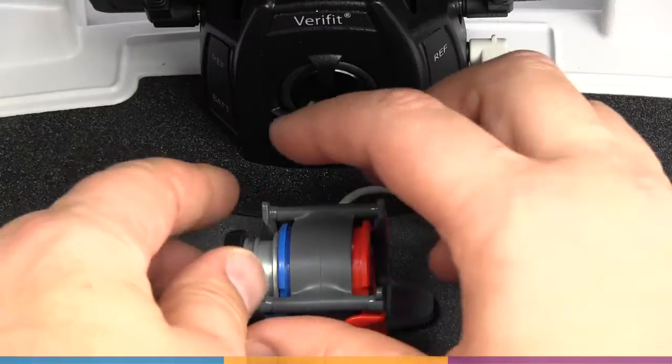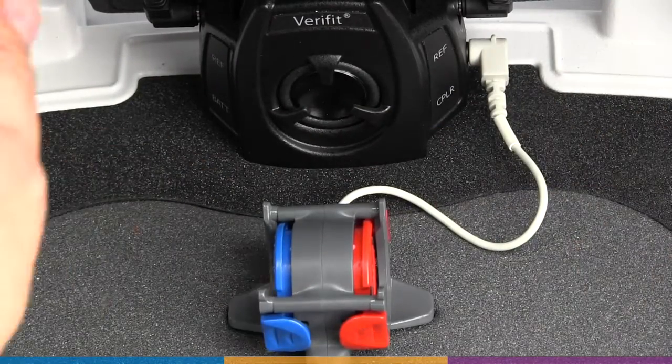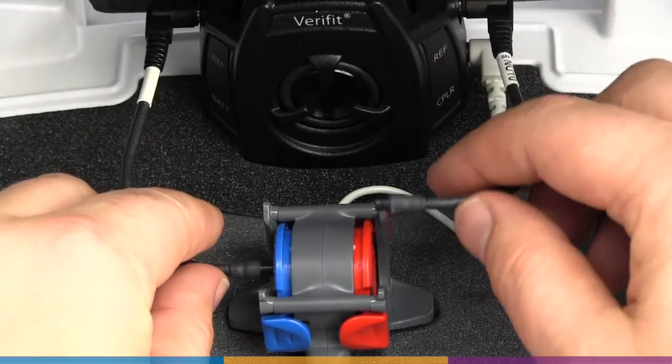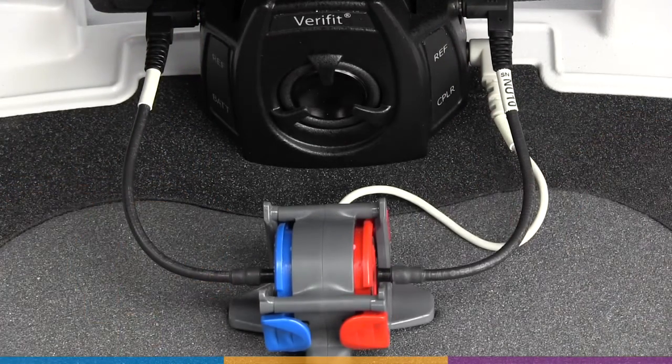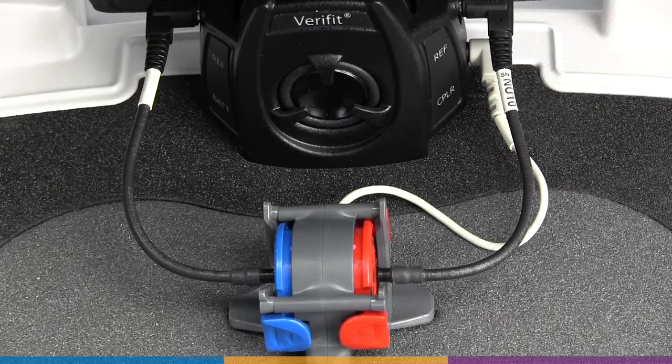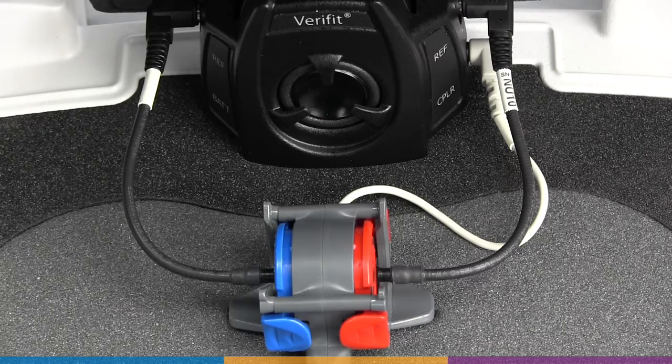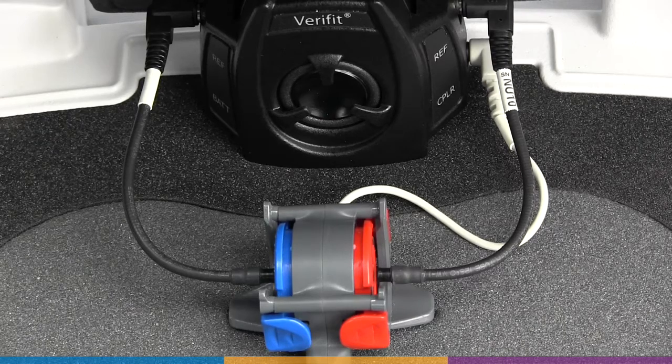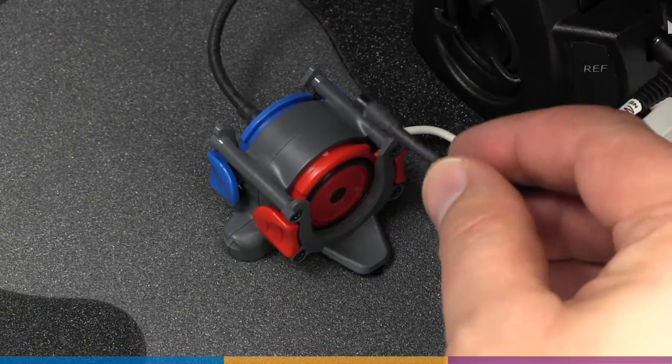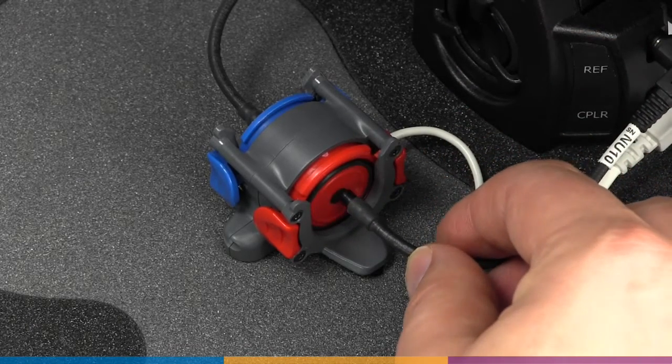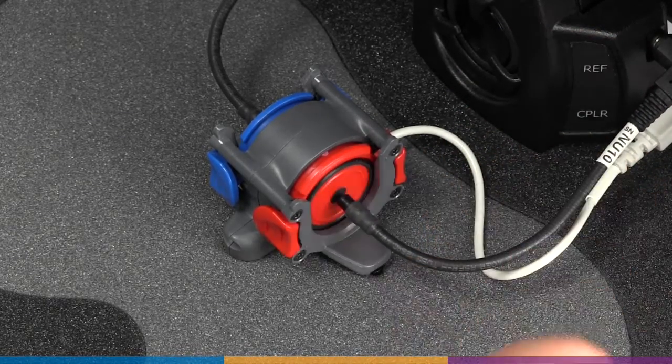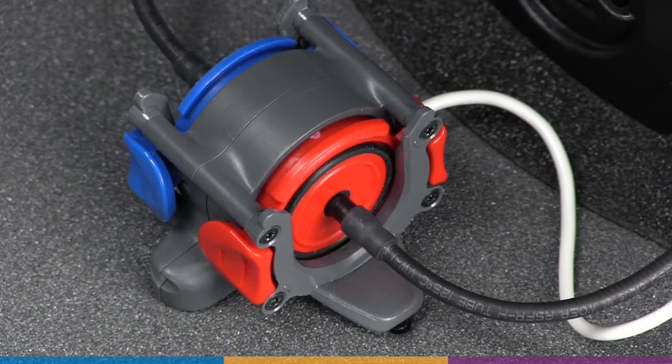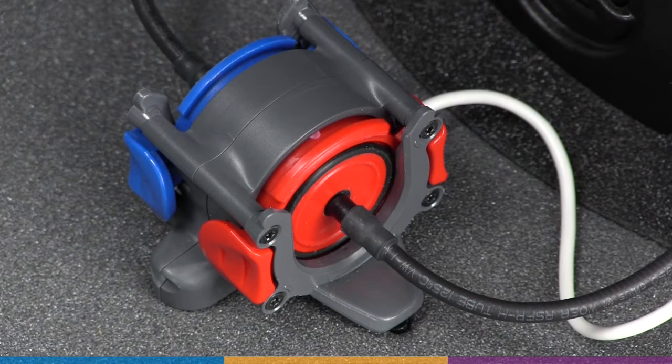On Verifit 2, both sides of the binaural coupler microphone must be calibrated. Position each reference microphone 1-3mm from the center opening of the coupler microphone. Due to the high frequency testing on the Verifit 2, positioning is slightly more important. The microphones need to be centered and close but not touching.